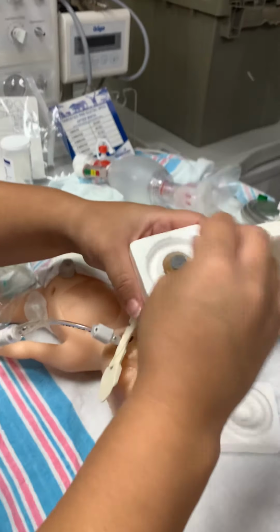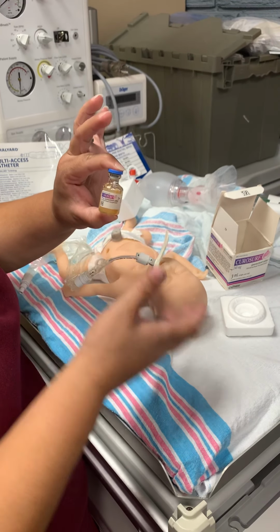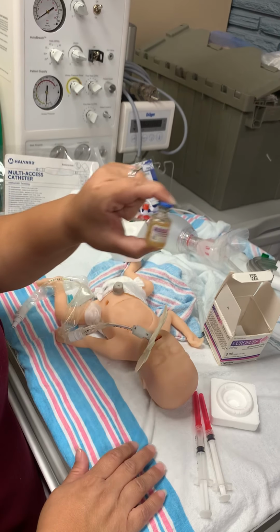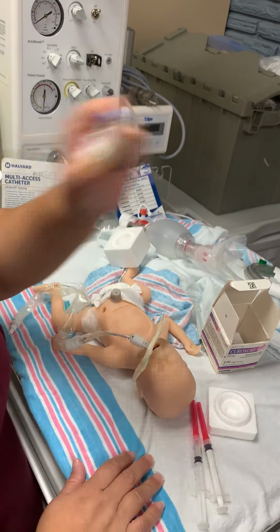So this vial, obviously it's expired, but you would be looking for a nice white, milky type of substance. Now we have to remember, it's gonna look like this. It'll be nice and white. We do not vigorously shake it. We're going to slowly turn it, swirl it around. If you do feel the need to shake it, we're gonna do slow and steady mixing action. That is because it does have some sediment towards the bottom if it's left there for a while. So we do want to make sure that the mixture is completely mixed up. But just remember, key thing, do not shake it vigorously because it will cause frothing and it could plug your tube.